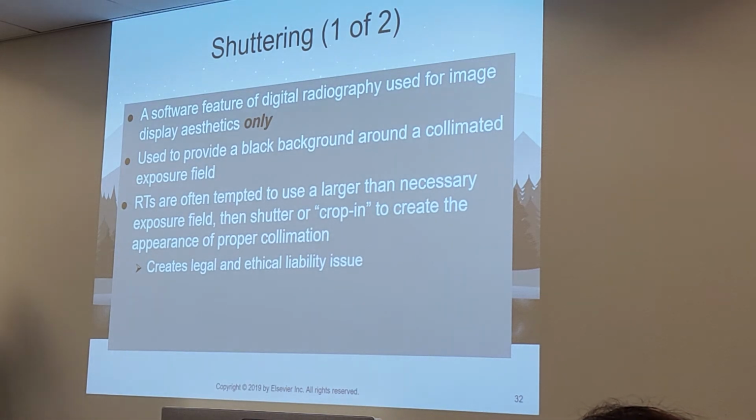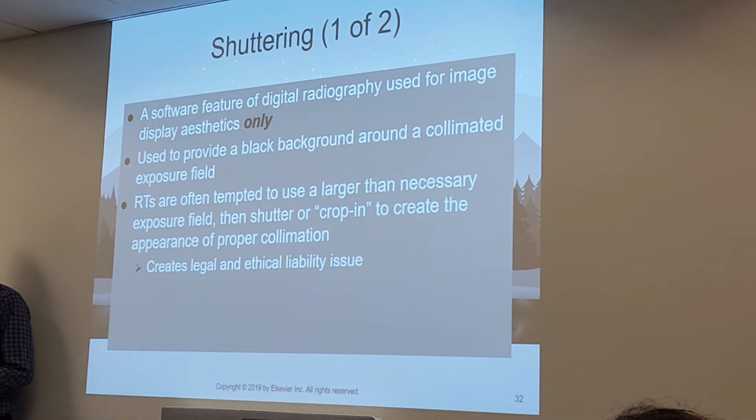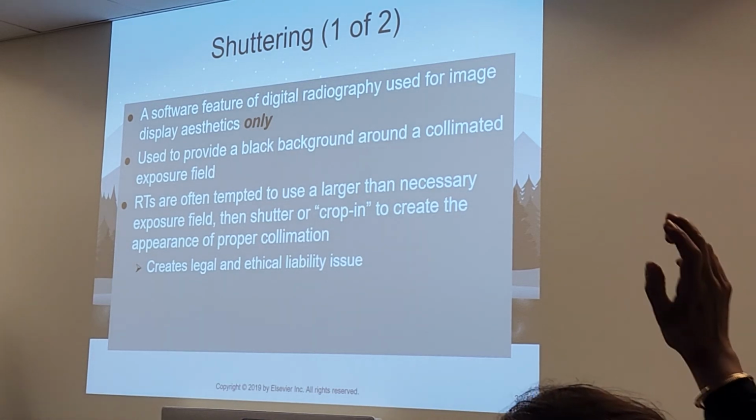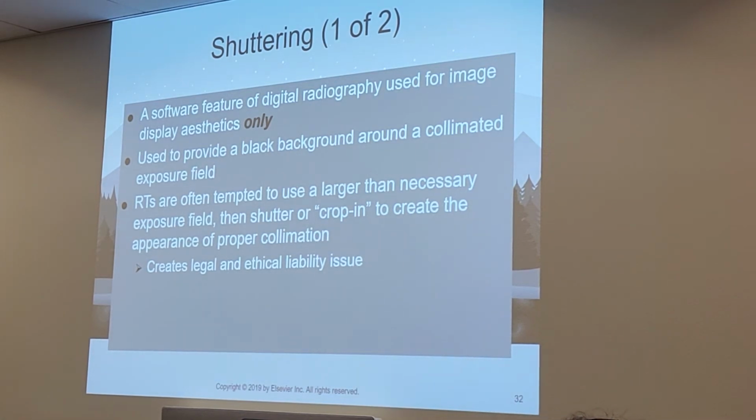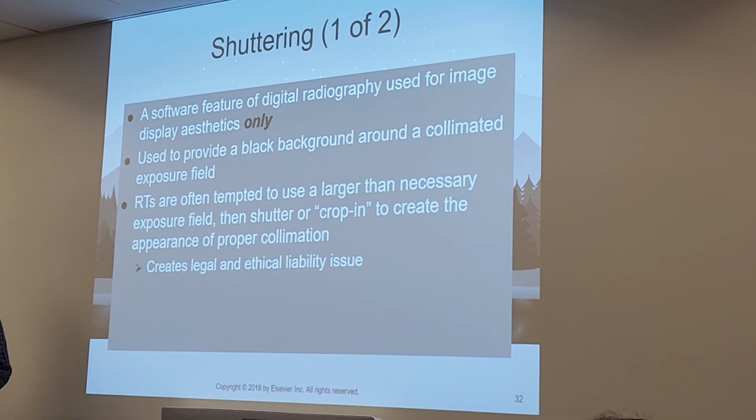But you should not be making a habit out of saying, well, I'll just fix it afterwards. That should not be your mindset. Some techs go in with that mindset. They'll say, I'll just keep it open, and then if I make sure I see what I need, I'll cut it down. Do not do that. Always try to have proper collimation. Yes?